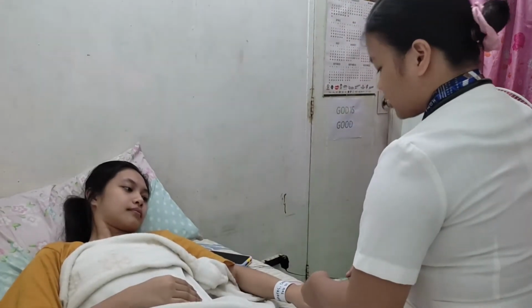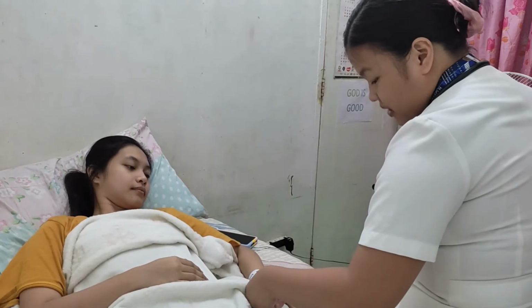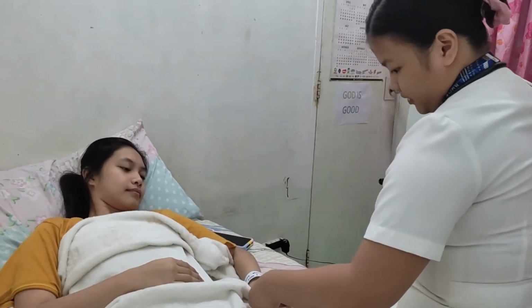Next assessment, we will check your pulse oximetry result using a pulse oximeter. This is one of the important determinants for the effectiveness of your pulmonary system. Also, this is to support your need for the oxygen therapy. So for your result, you have an oxygen saturation of 90 and a heart rate of 77 beats per minute. It means that we need to administer oxygen via nasal cannula.